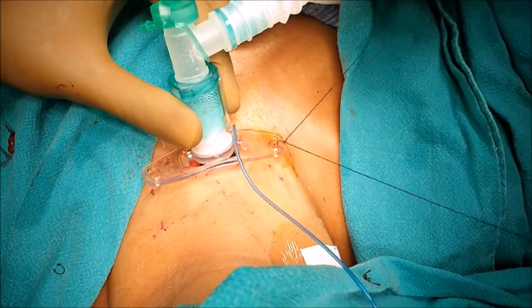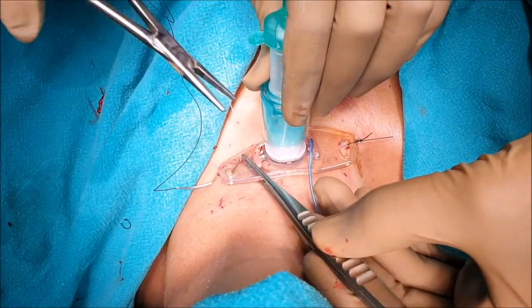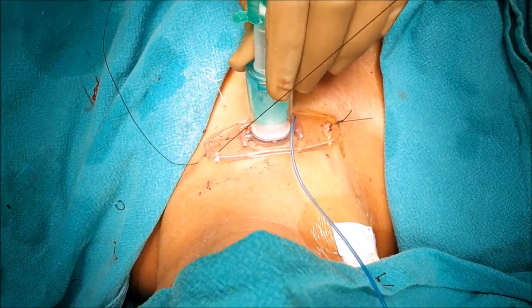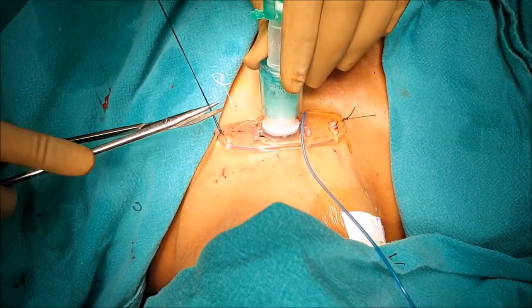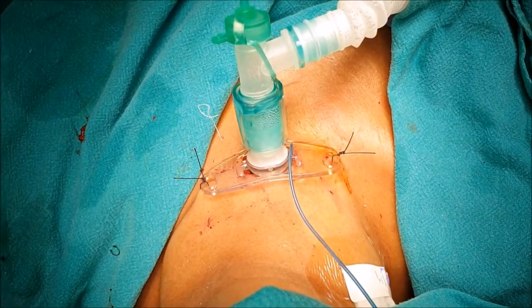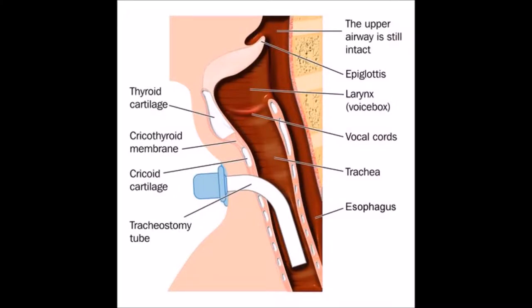To prevent the fall of the tracheostomy tube, with the help of silk sutures, the tube is fixed on both sides. This is the appearance of the tracheostomy tube after completion of the surgery. Thank you.